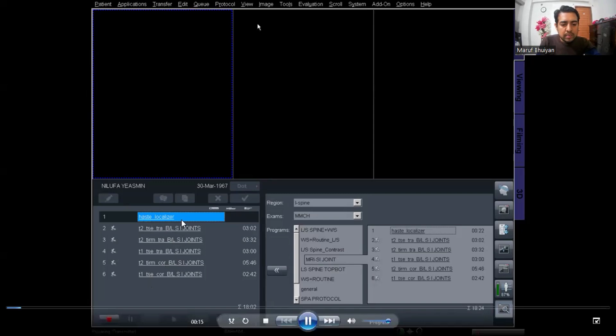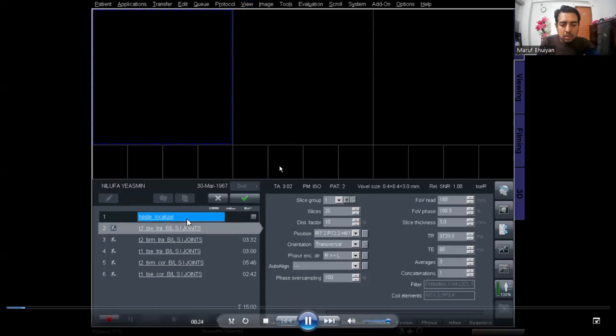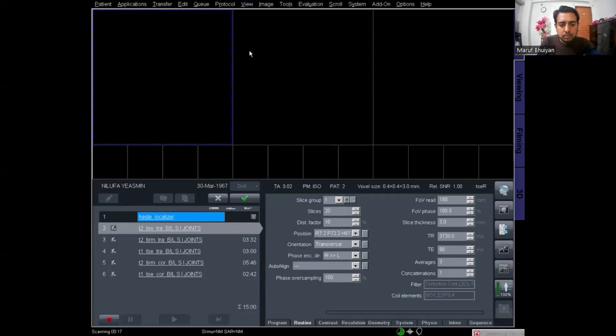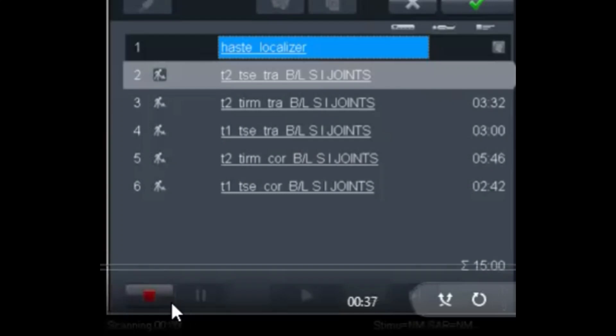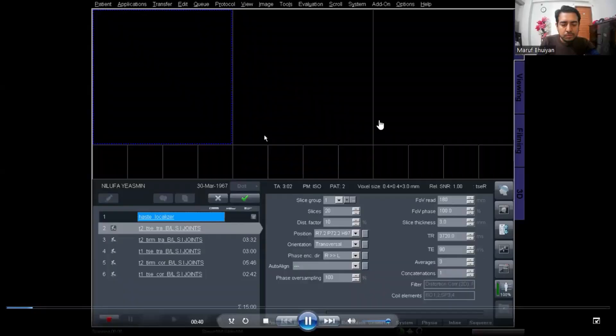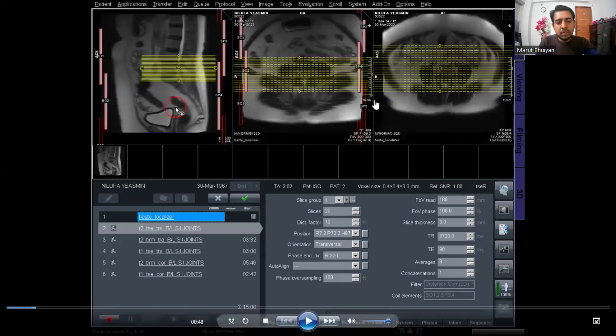Now the localizer is scanning and will give us the primary image for planning. Look at this corner — the time is running for the scanning. I got 3 images from the localizer: the first one is a sagittal, the second one is the coronal, and the third one is the axial localizer. Now we plan these protocols over these localizer images.